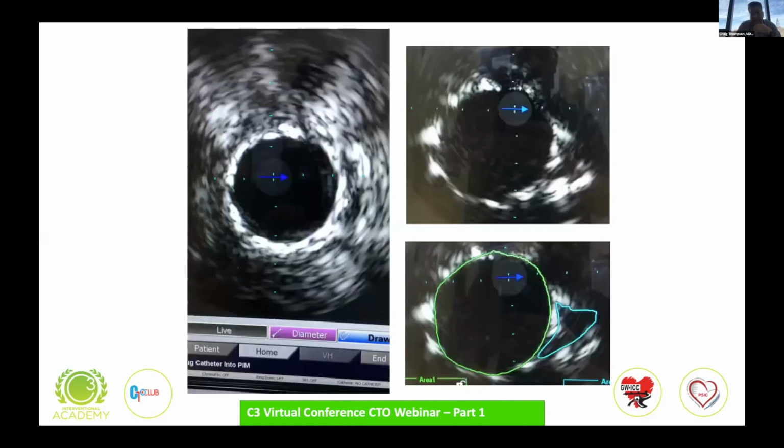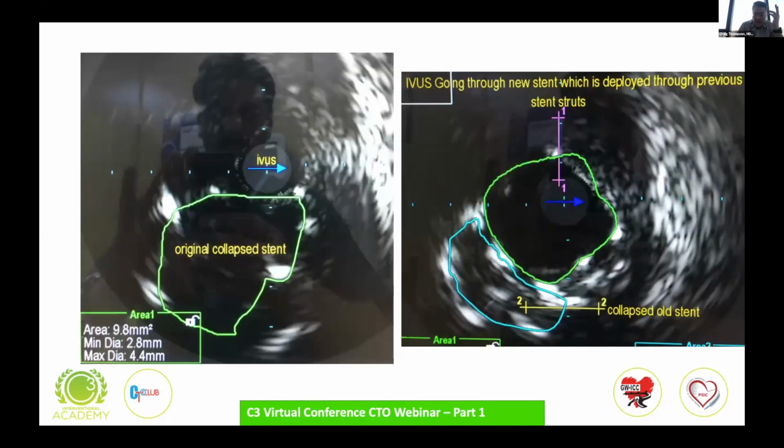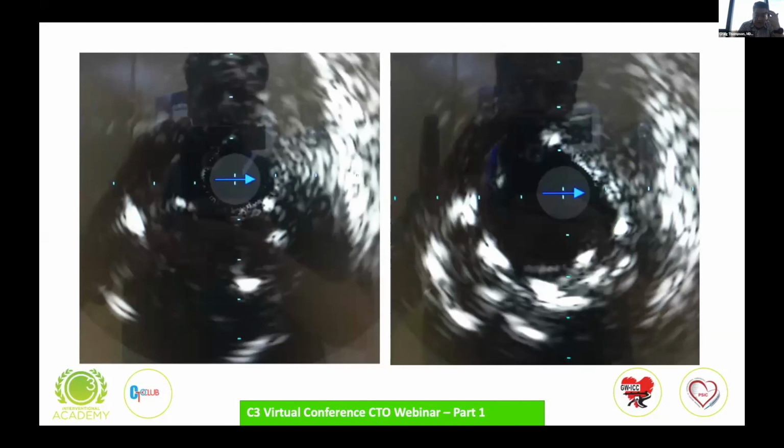I think it's an excellent example of having to recreate what you want to accomplish. If you're through a side strut, we find in CTOs and other areas that you're in a strut and need to crush things aside. But if you do it like this, using imaging intelligently, sizing it, really getting it optimized. And for me, the learning lesson from this case is, how do you end a procedure with an exquisite and perfect result, which technically speaking will end up with a great result for the patient? And this is just a wonderful showcase.